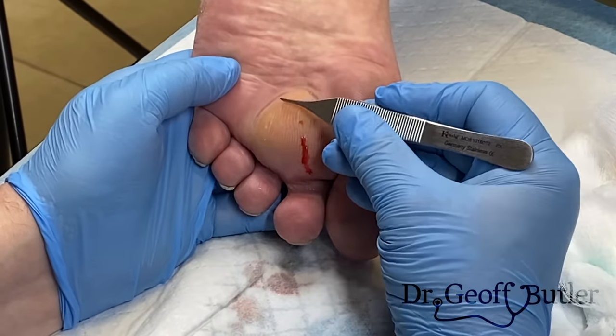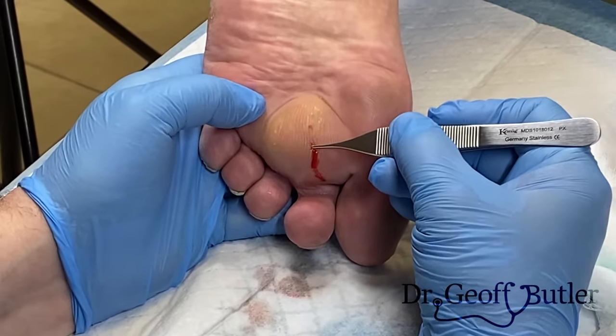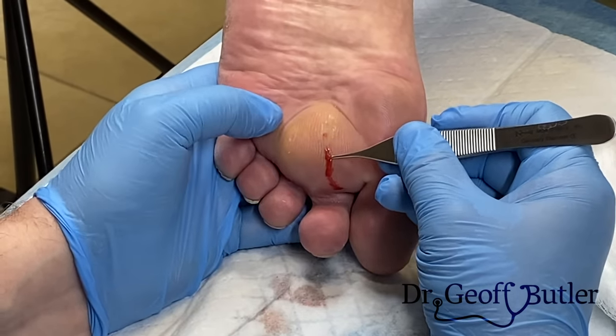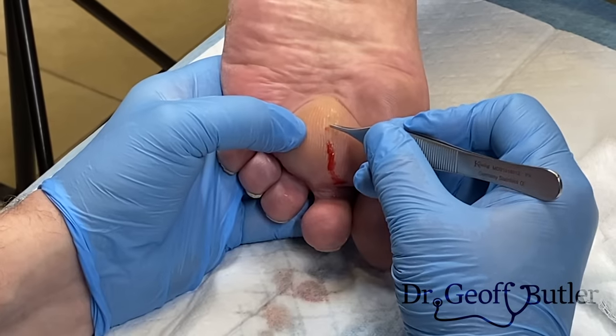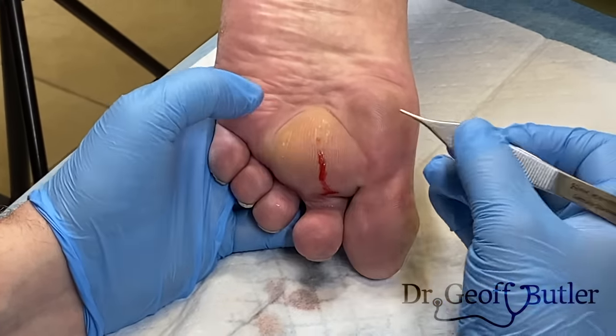Is this infected material? It doesn't look overly red, but really quite distended. We've added some freezing along this line. You've seen enough of these procedures to know that if there's a lot of infection the freezing doesn't work so well, and the other problem is when it's swollen like this we add a lot of pressure. So what we're going to do now is incise gently along this line and see what we're dealing with, then move from there.